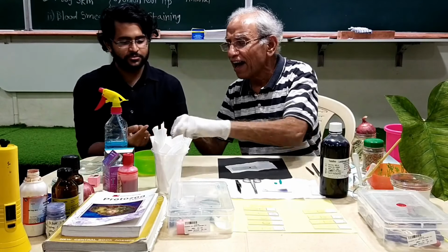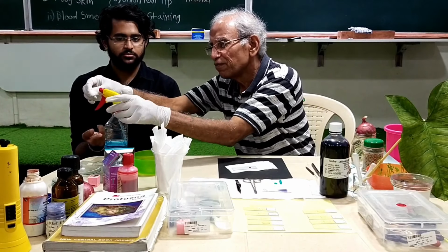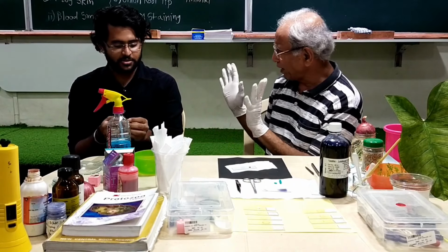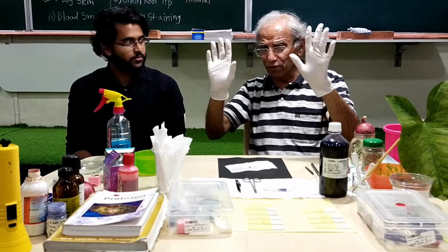Okay. That's very fine. I think I have another cotton piece to sterilize once again, because you need to sterilize the things. Okay, it's very simple. Yes. You did not find any pains, right? No. Okay, and I'm discarding this, very important. I'm just discarding it. You don't have to use it again.